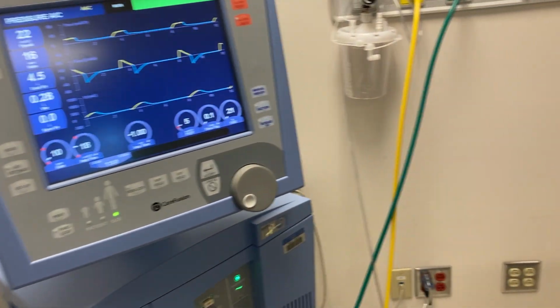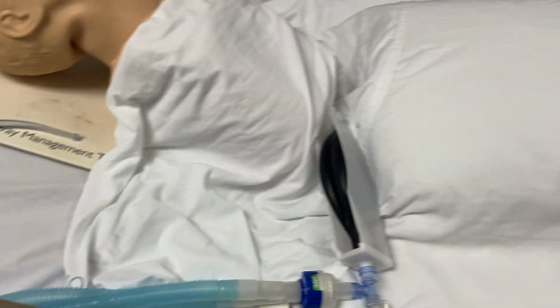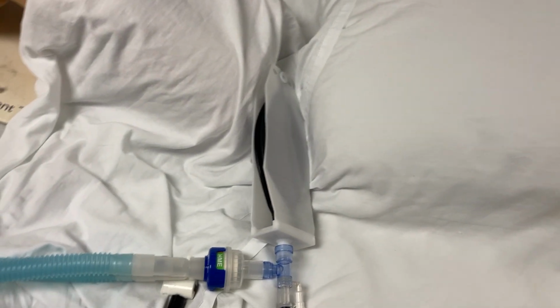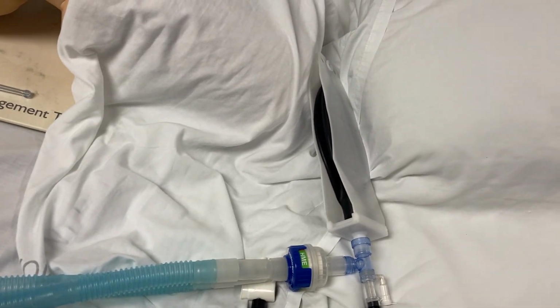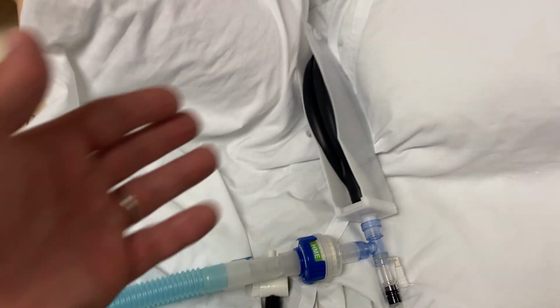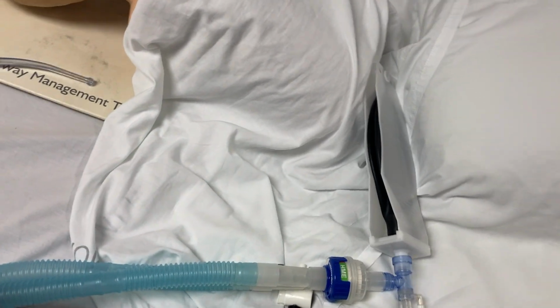Let's pretend for all intents and purposes that this patient is intubated, obviously mechanically ventilated, and they've been given a paralytic. So whether it was succinylcholine, vecuronium, pancuronium, cisatracurium, whichever, they've gotten some type of paralytic, whether a depolarizing or non-depolarizing agent. If they're paralyzed, that means they should not be breathing any above that set rate. And you can also tell that there are no electronics hooked up to this test lung. There's zero electronics, so it has no ability to spontaneously breathe on its own.